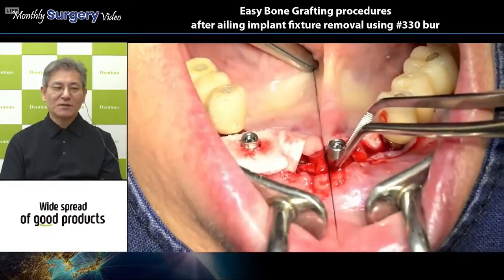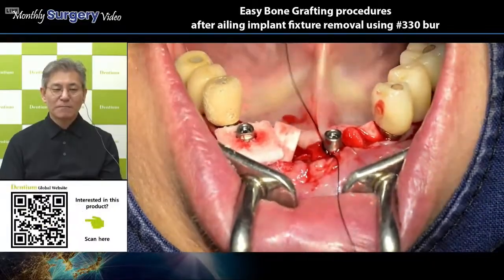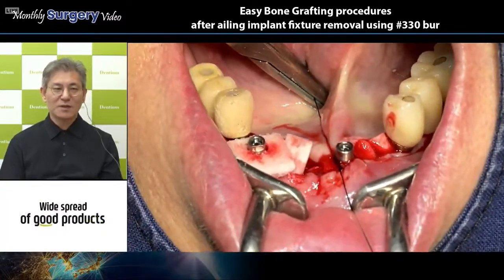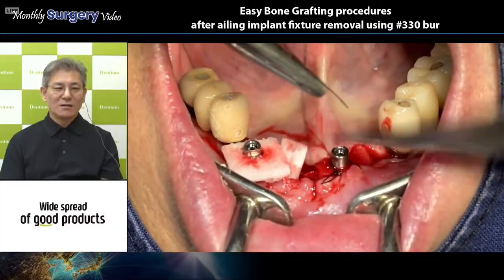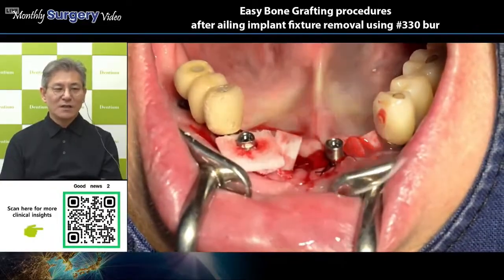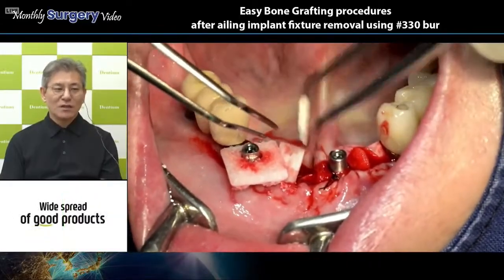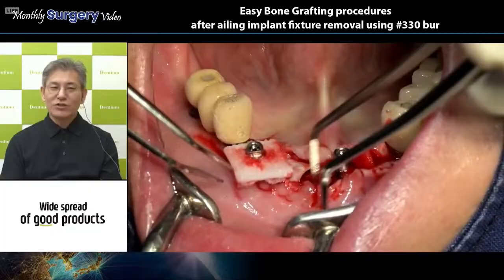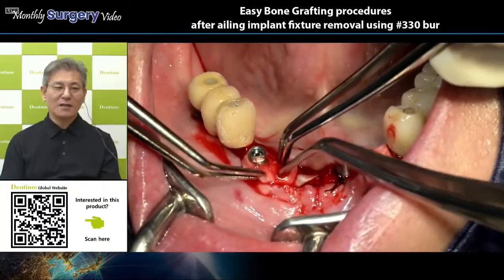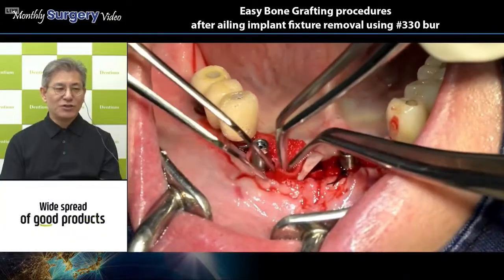This collagen graft holds the blood clot and activates the cells to make new bone, the bone cells and the plasma and the blood, and finally blood vessels engage this collagen graft, and finally make faster epithelialization. It means faster soft tissue wound healing, right? So this phenomenon I can explain as vascular driven epithelialization.